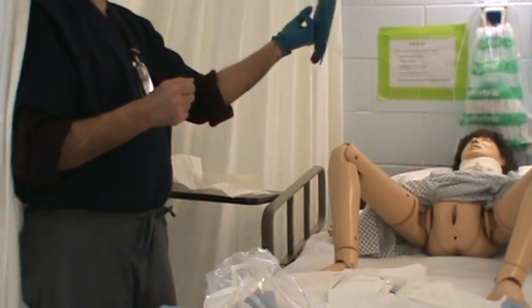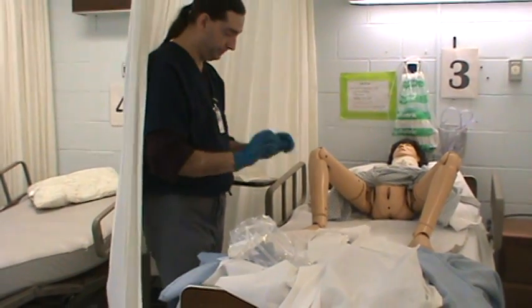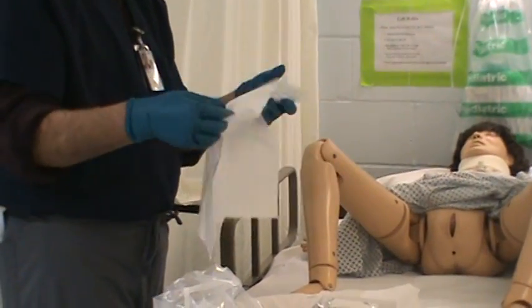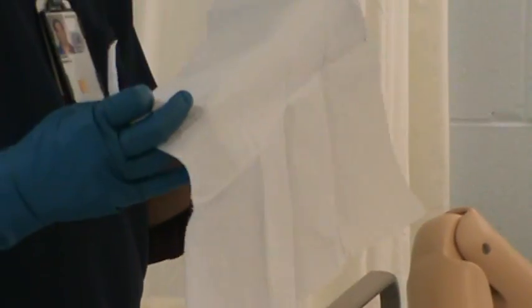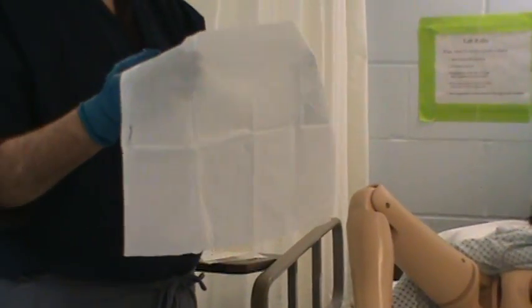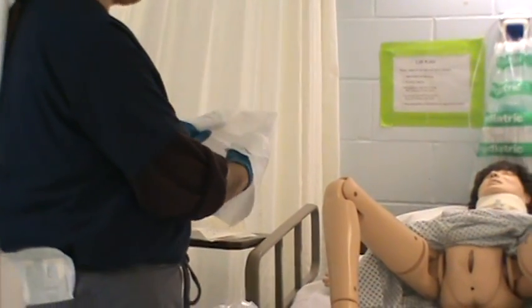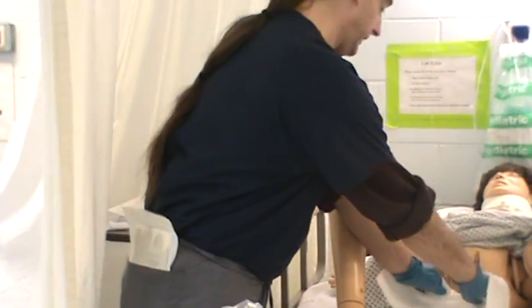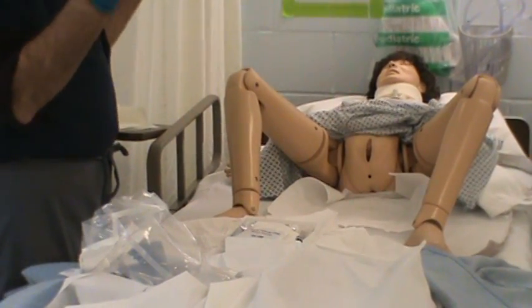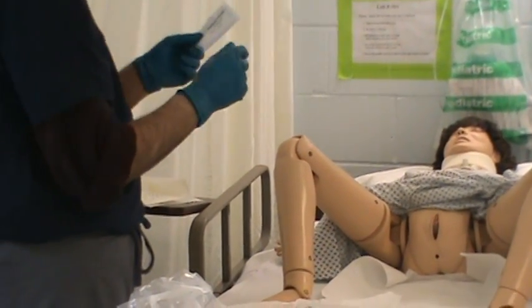If you do contaminate your gloves, simply say, 'I did that improperly, I'm going to have to get a new set of gloves.' There's a shiny side and a material side — shiny side down. Now I have on sterile gloves, so I don't want my hands to touch anything or they'll be contaminated. My patient can lift themselves up, so I'm going to have them lift up and I'm going to tuck this under and pull out — not touching anything. If I did accidentally touch something, I would have to get my second gloves.